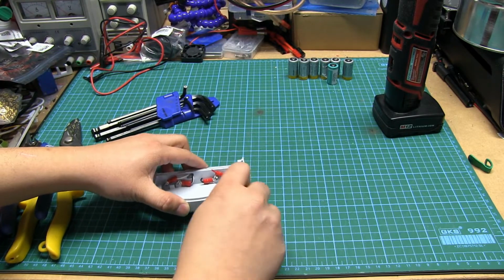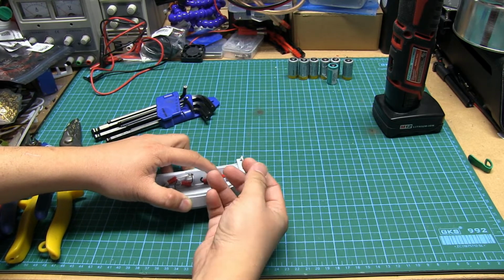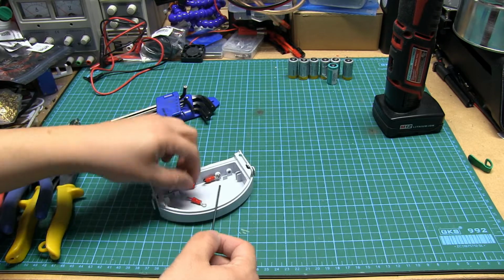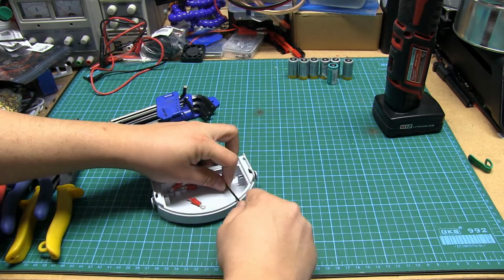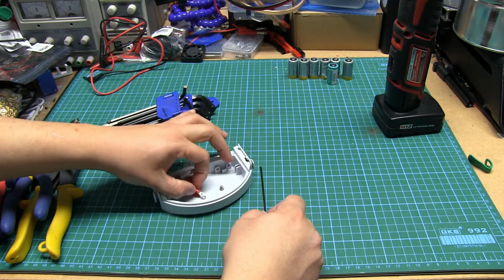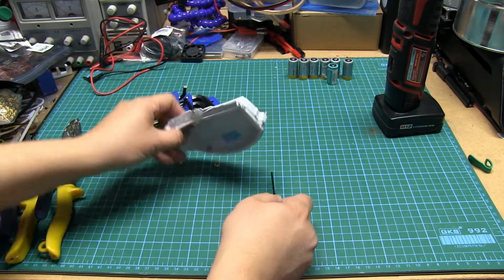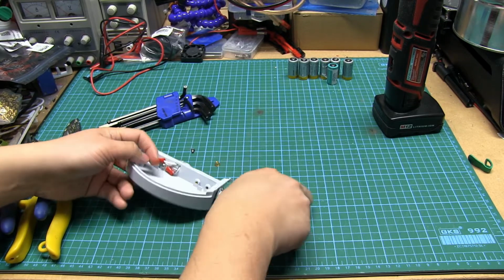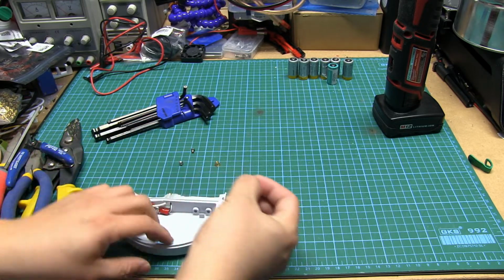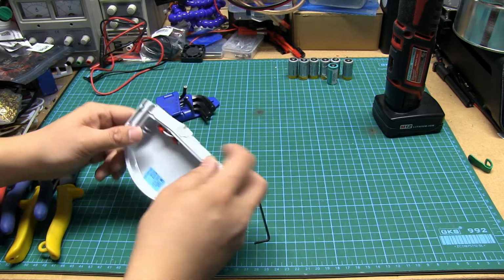Let's try and get in here with an angled head Allen key. Indeed we can. Let's take a look at these screws. These appear to be M3s. Nothing spectacularly special, these are just regular ring terminals. The terminals themselves, however, do seem to just pop right out. So these are separately machined pieces that do insert into the housing. The housing is nothing spectacular, it's just a piece of injection molded plastic.